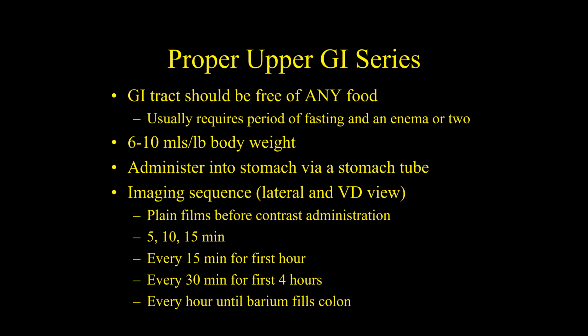So typically you're going to shoot a lateral view, a right lateral view, typically in a VD view at 5 minutes. You're going to repeat it at 10 minutes. You're going to repeat it again at 15 minutes. And then you do it every 15 minutes for the first hour and every 30 minutes up to 4 hours. And then you keep going about every hour, every 30 minutes until the great majority of the barium's in the colon. So nobody likes to do these.